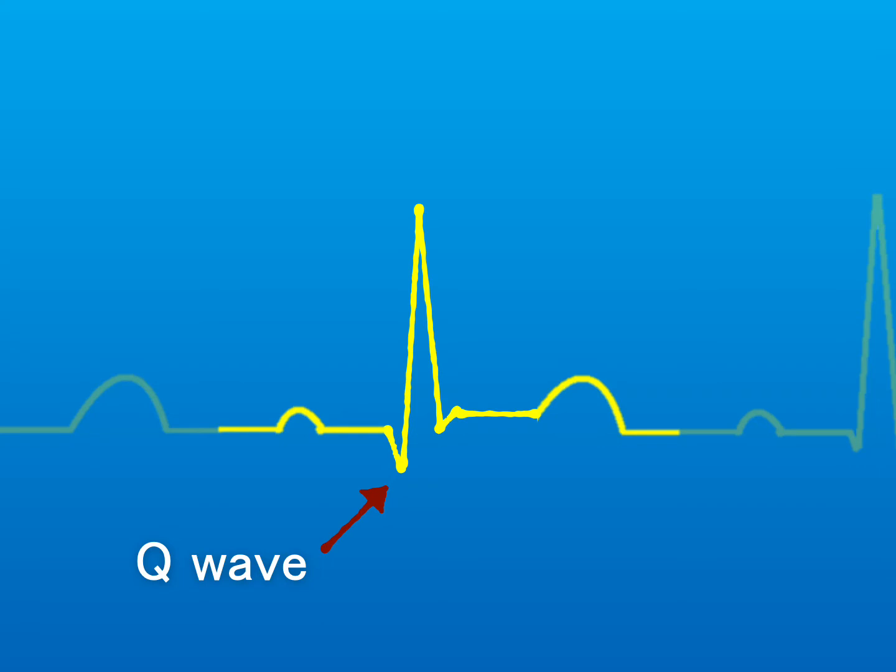But nowadays, with more and more PCI, we see that the tissue can be reperfused, and in some cases the Q waves can resolve, but not always. So what are Q waves?